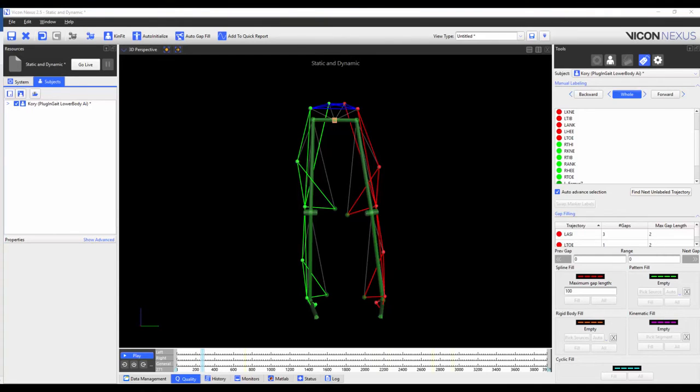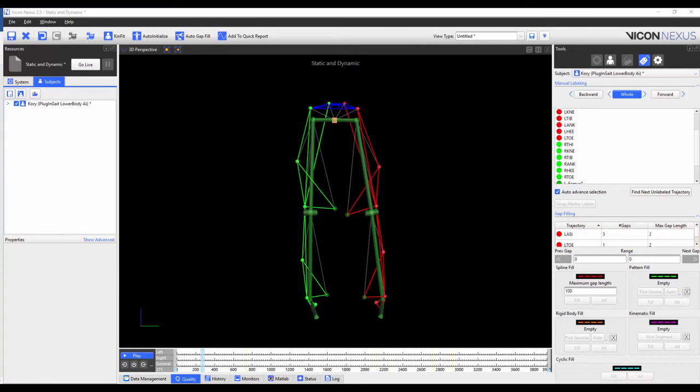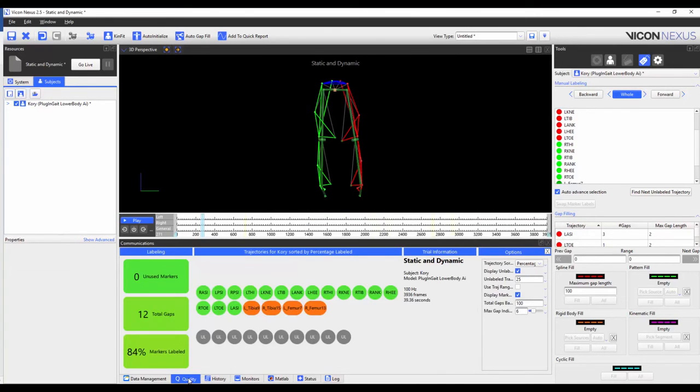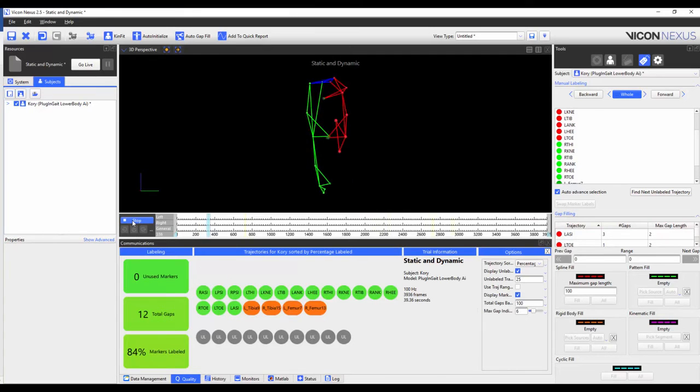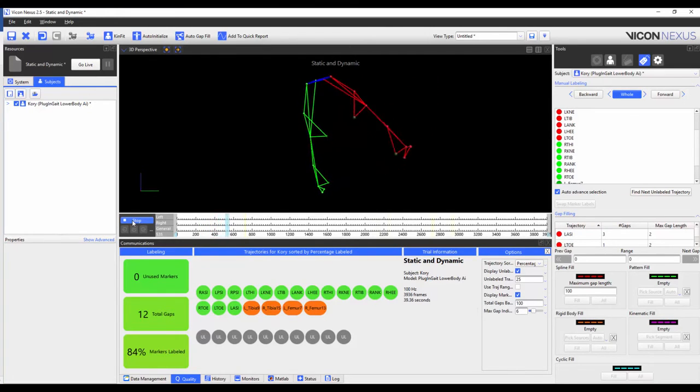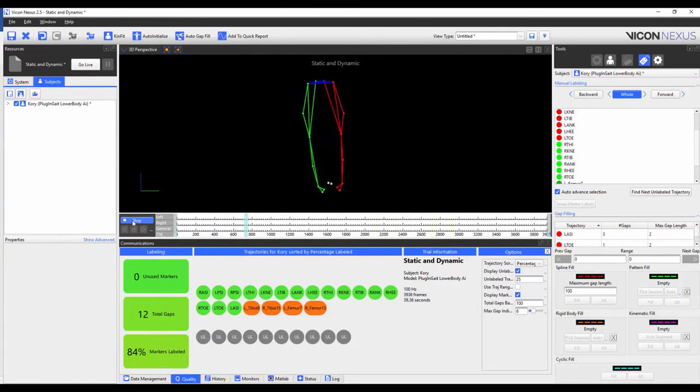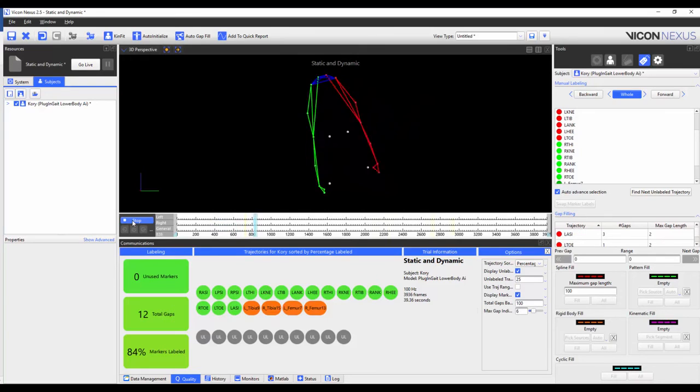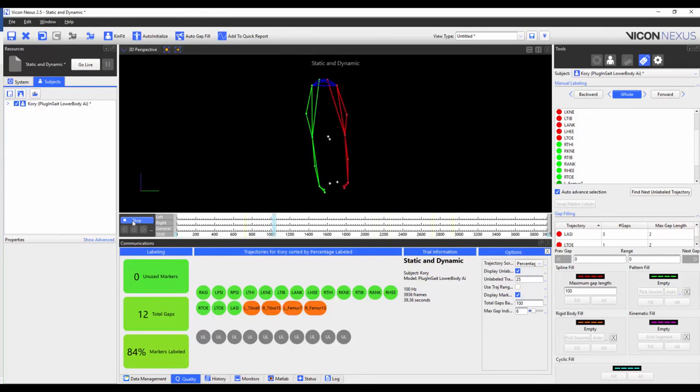After the markers have been added and the marker properties have been adjusted, I now need to go through and make sure that all the markers are properly labeled throughout the trial. As we can see from the quality tab and when we play through the trial, the new markers become unlabeled.